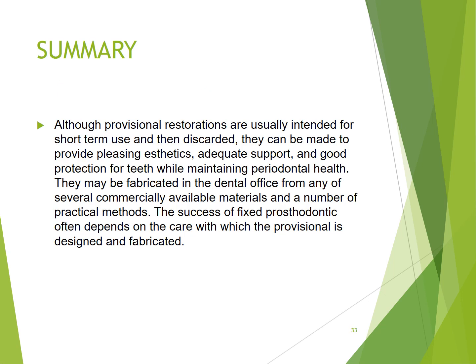Okay, so coming to the summary, provisional restorations basically are for short-term use, and then it is actually discarded. They can provide pleasing aesthetics, adequate support, and good protection for teeth while maintaining periodontal health. They may be fabricated in the dental office from any of the several commercially available materials, and a number of practical methods are available. The success of fixed prosthodontics often depends on the care with which the provisional is designed and fabricated.